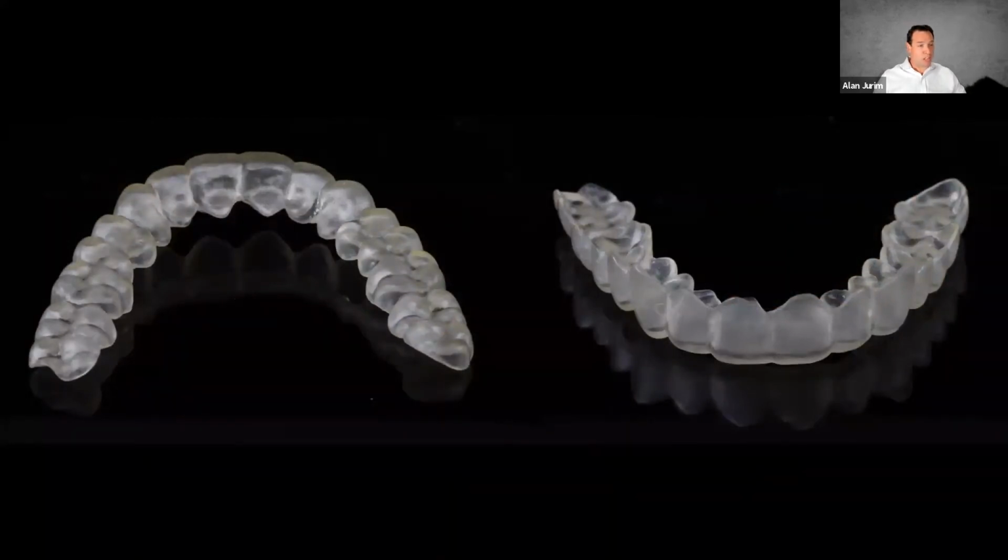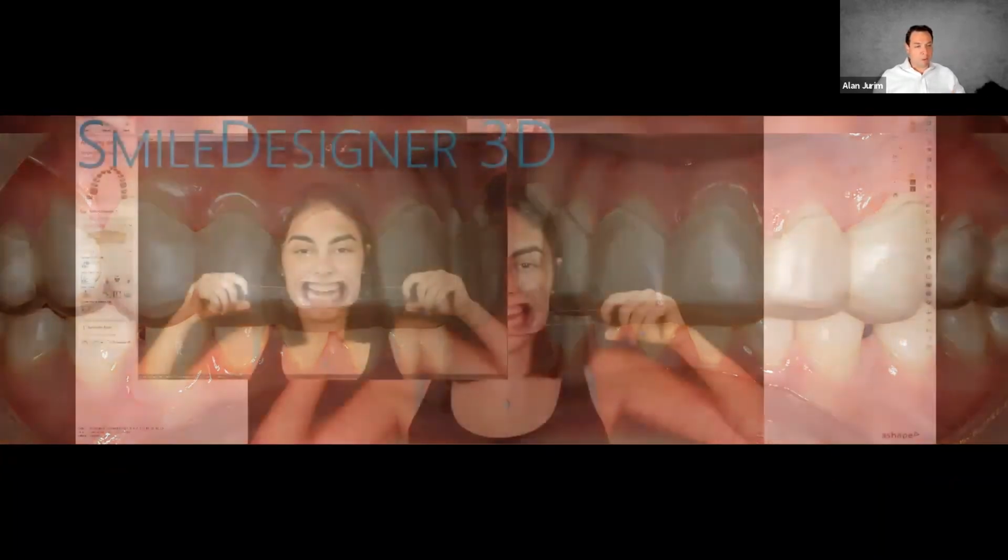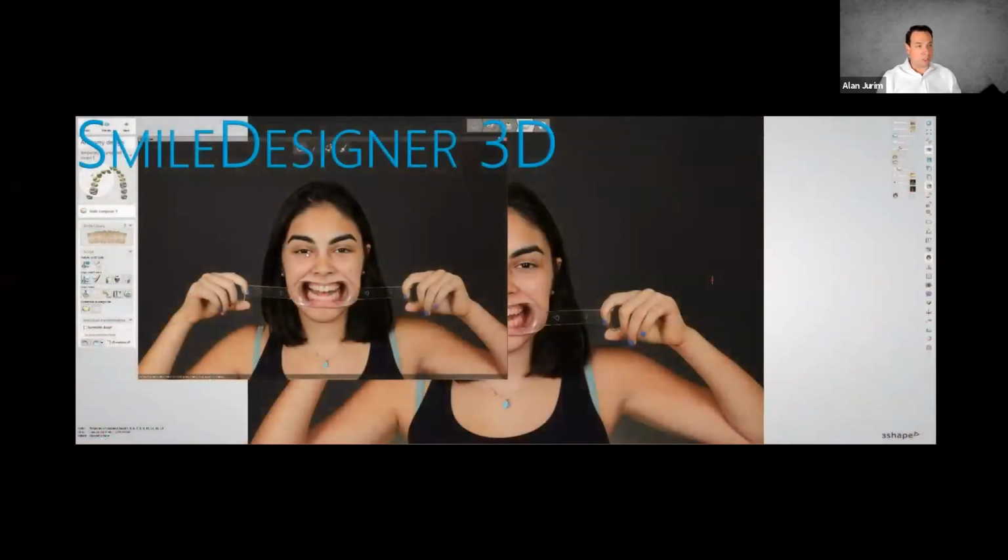This was an older design. Now we're able to design ramps in it, and we're able to identify and adjust occlusion better. And also we have more predictable fit. If I'm looking back at these images now, I'm saying, look, I don't really think that was fitting as good as it should. But this is always how I learn. I learn by looking at the photos afterwards, and I learn by studying. And the good news now is the development of the materials for digital splints and just how well it's become with the overall parameters and the fit is by far one of the most satisfying parts of our digital printing.